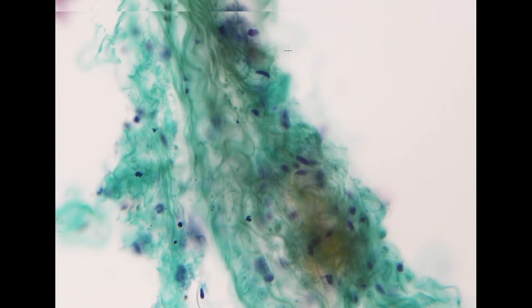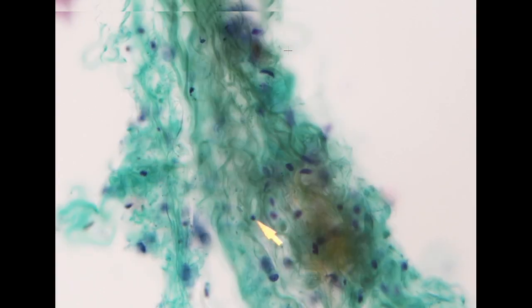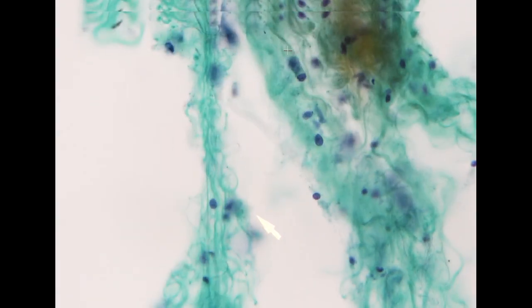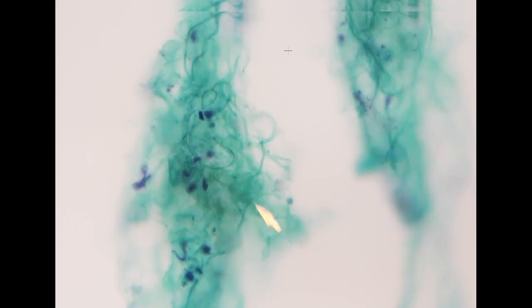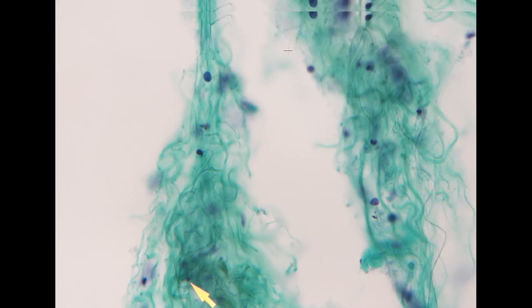This is what we see in histology as desmoplastic type stroma. You can see that this looks like a disorganized proliferation of stromal collagen fibers.